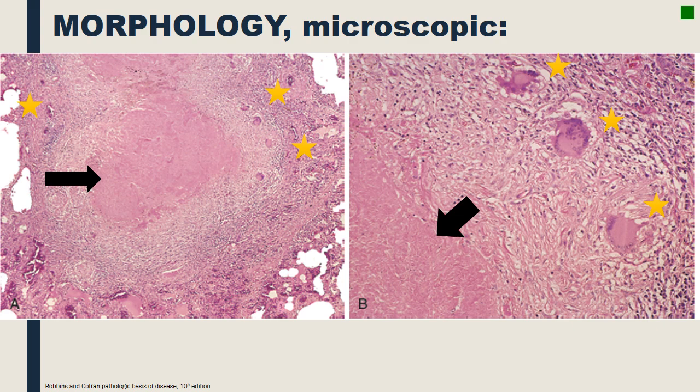Histologically, sites of infection are involved by a characteristic inflammatory reaction, marked by the presence of caseating and non-caseating granulomas, which consist of epithelioid histiocytes and multinucleated giant cells. Let's view the morphologic spectrum of tuberculosis.